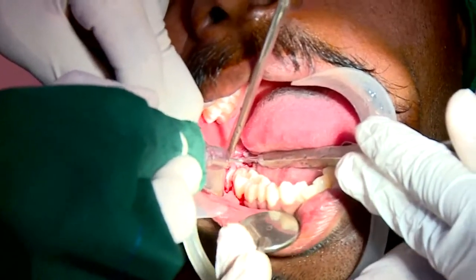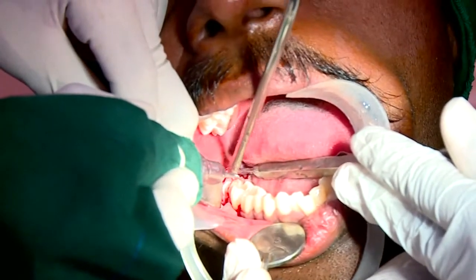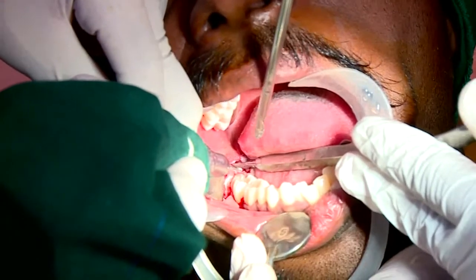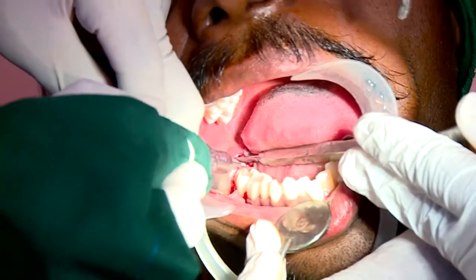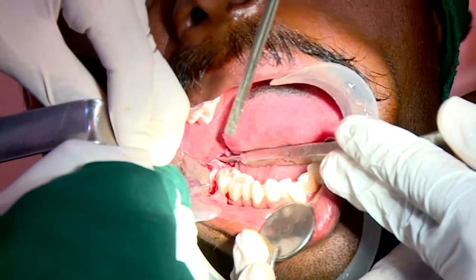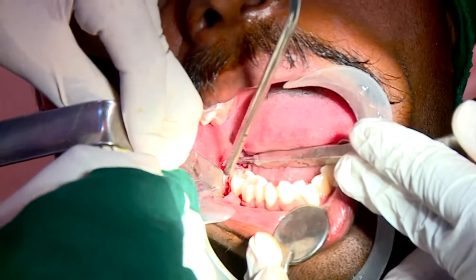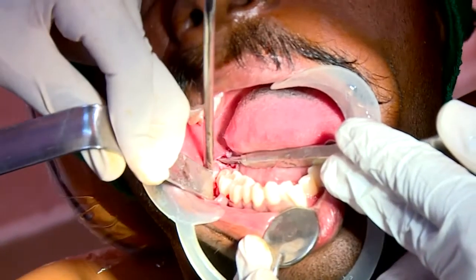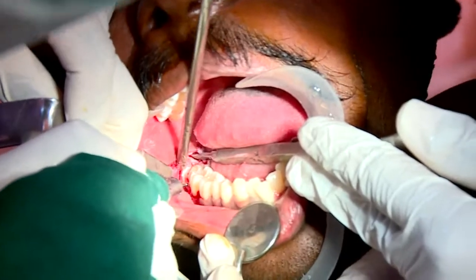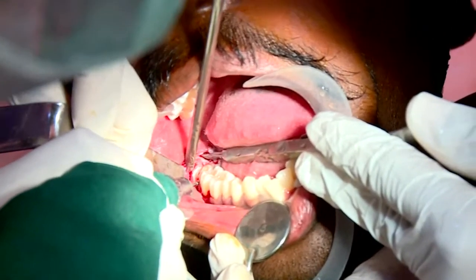So what I'm going to do is further longitudinally split the crown. Okay. Still it resists the normal force and it's not very easy to remove it. So I'm going to make a longitudinal cut on the crown, so that I can remove the upper half and lower half. So now further splitting the crown. Okay, so we take the crown out in 2 pieces.